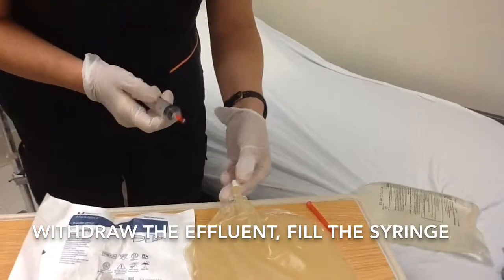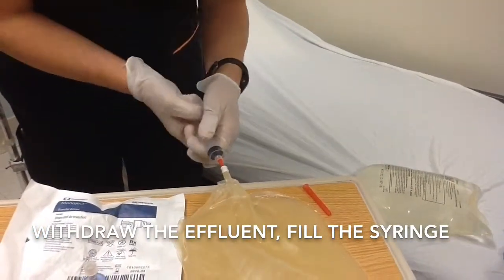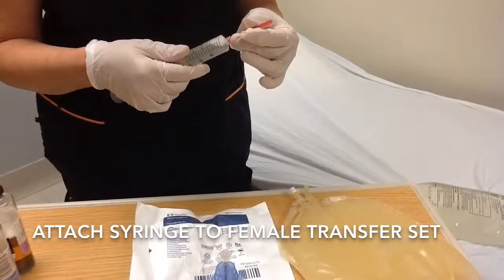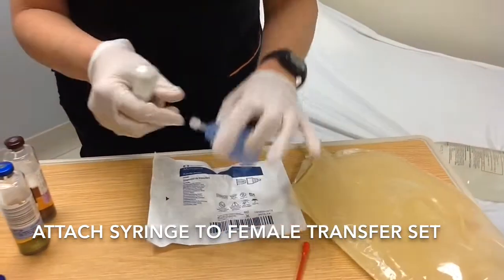Withdraw the effluent in the syringe. Remove the red blunt needle and attach to the female transfer set.